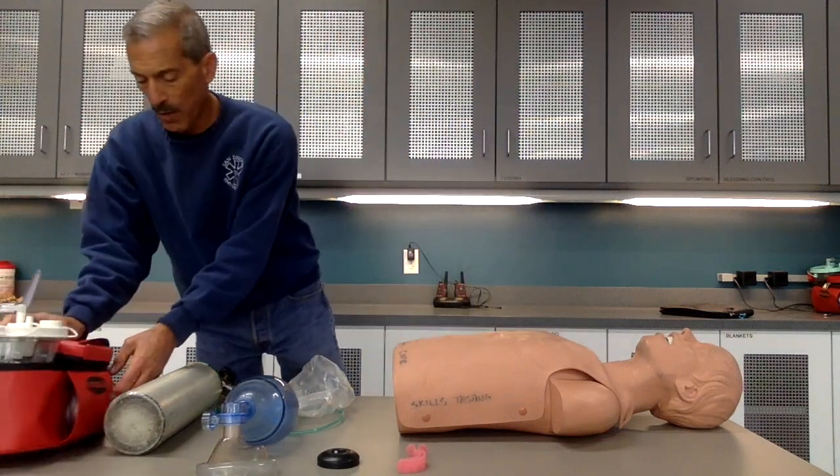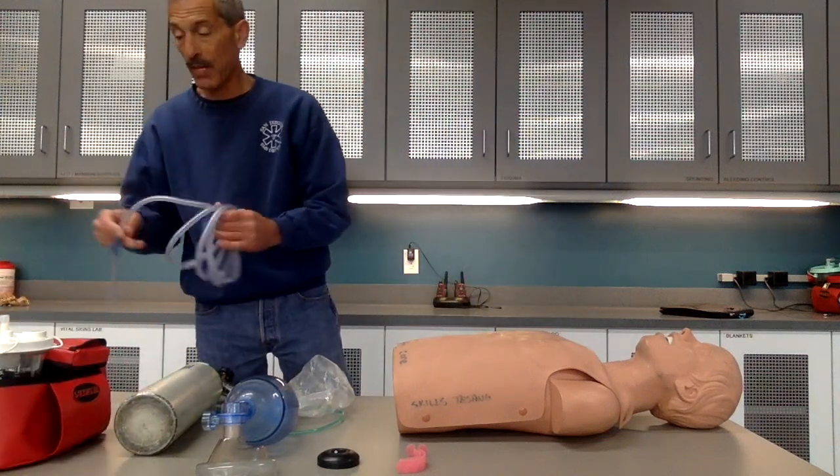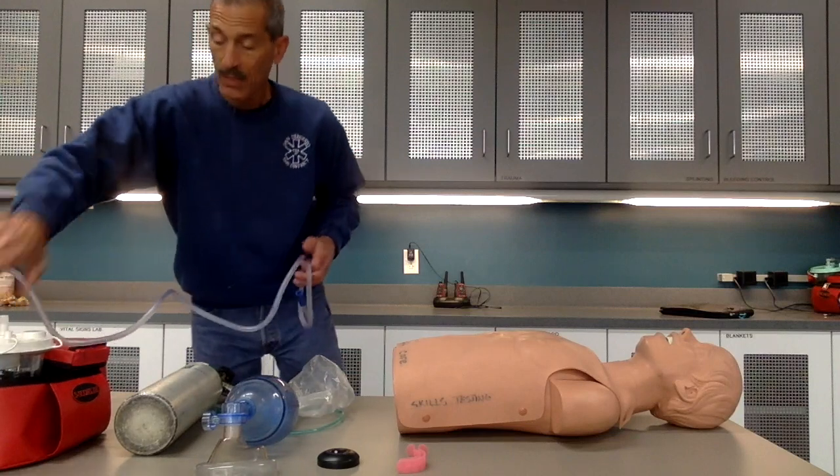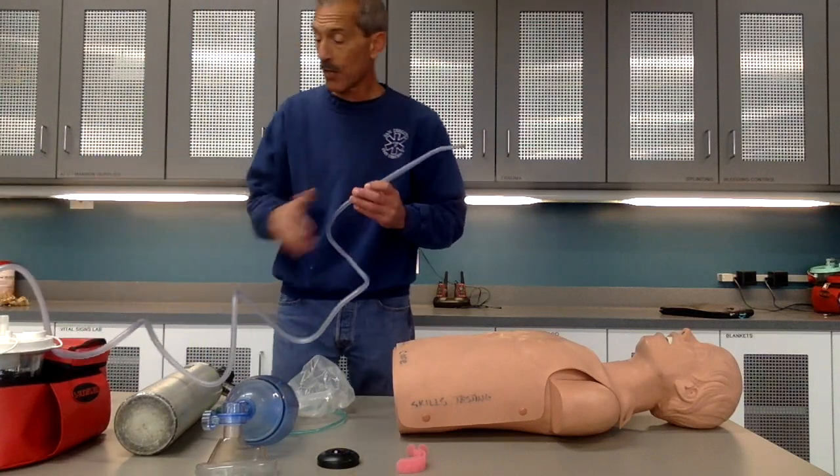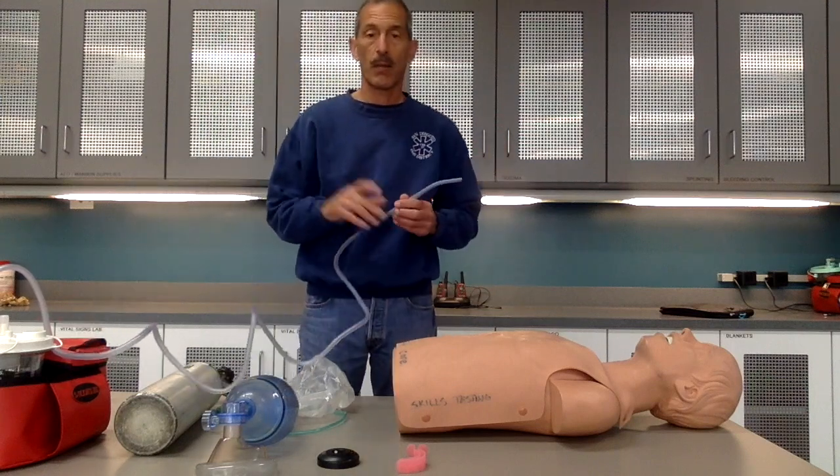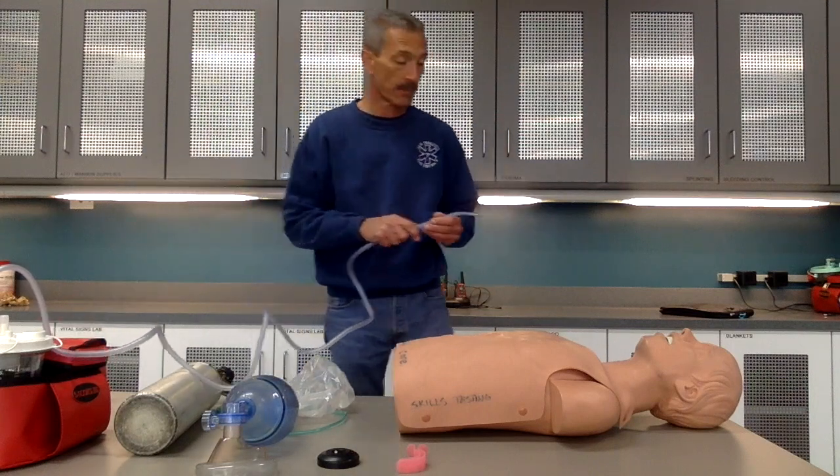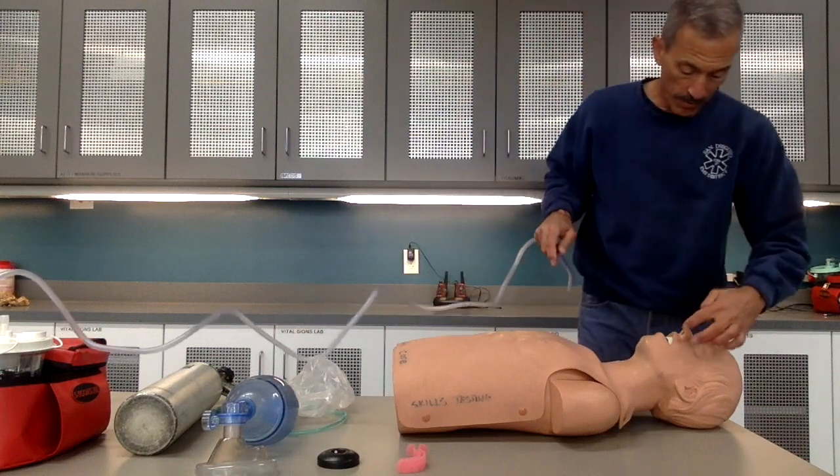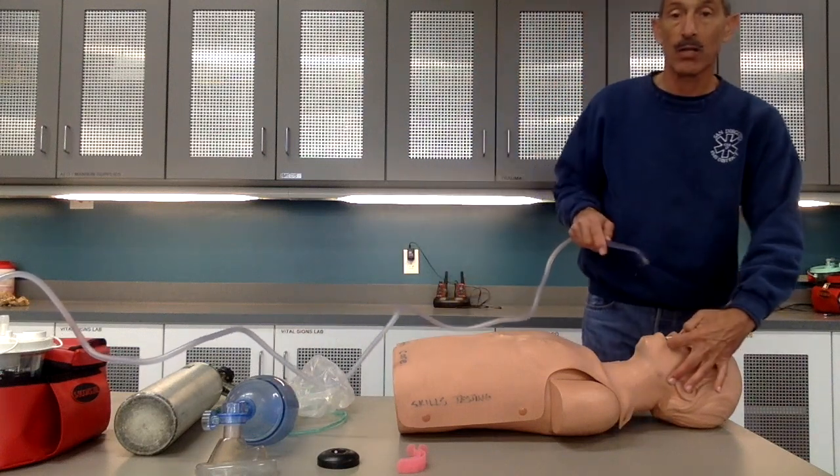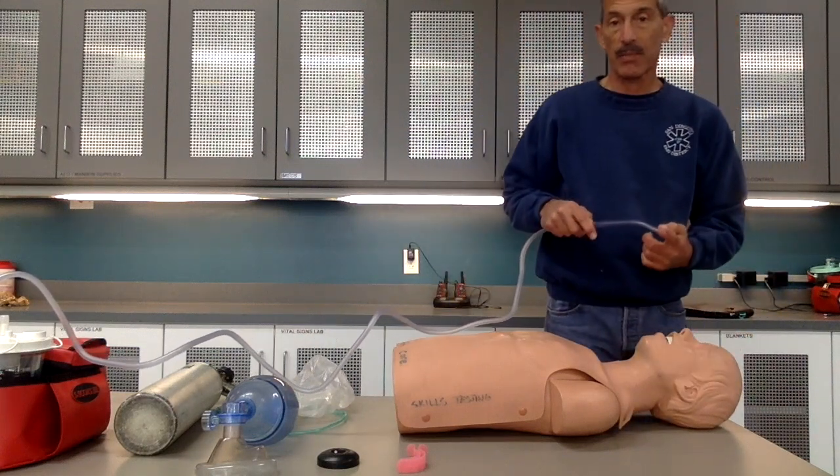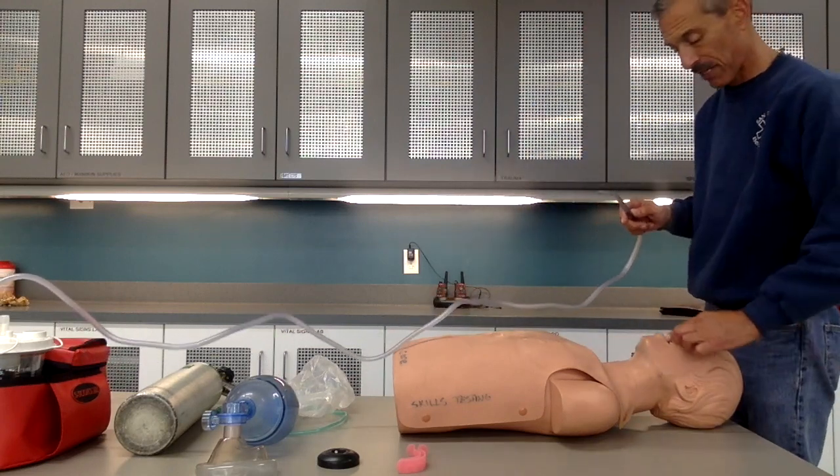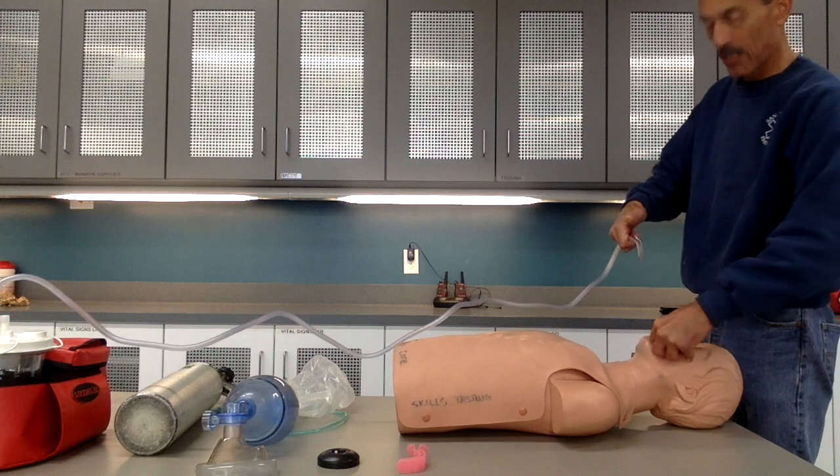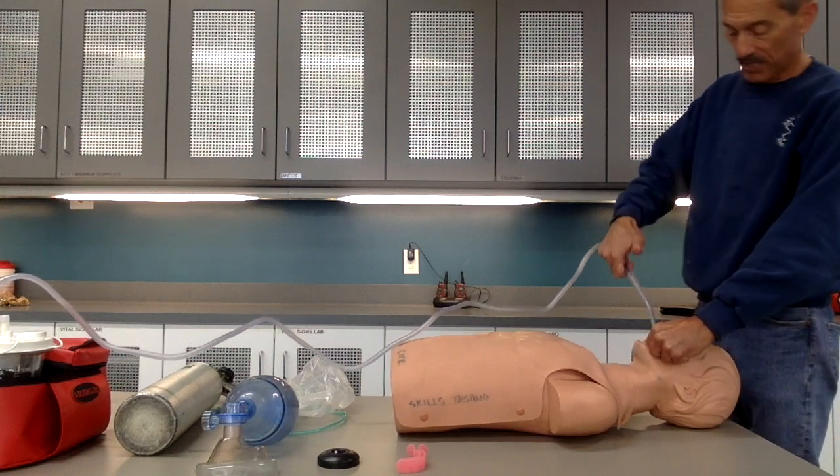I'm going to attach my suction tubing to the patient port, attach my suction catheter to the tubing, turn on the device and test it. The proctor will turn it off for me. I'm going to measure from the corner of the mouth to the angle of the jaw. I'm never going to insert the tip past the base of the tongue at any time. I'm going to open the mouth using the cross finger technique and I'm only going to suction on the way out and no more than 15 seconds.